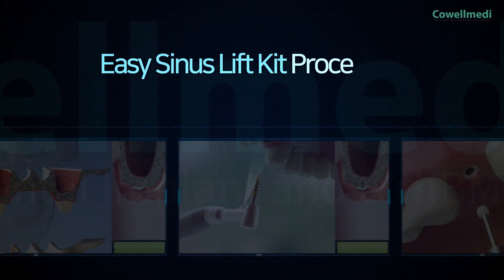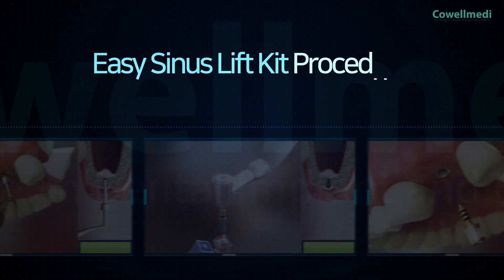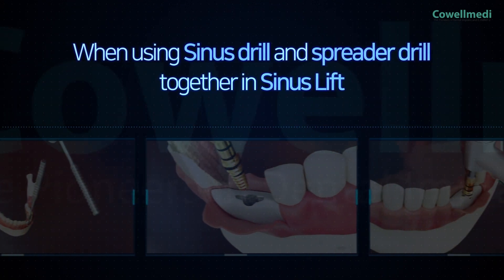Let's take a look at the features of the Easy Sinus Lift Kit through the procedure. First, the Sinus Lift Drill and spreader drill are used together for maxillary sinus lift.